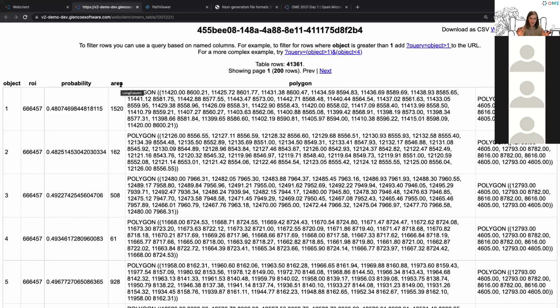You might have many more and interesting measurements than what I have here, but I'll use these 2 to sort of illustrate the concepts. And for those interested, this is just a representation of the geometry of that object itself and the tile from which it was segmented, but I won't make use of them today, so we can effectively ignore them.